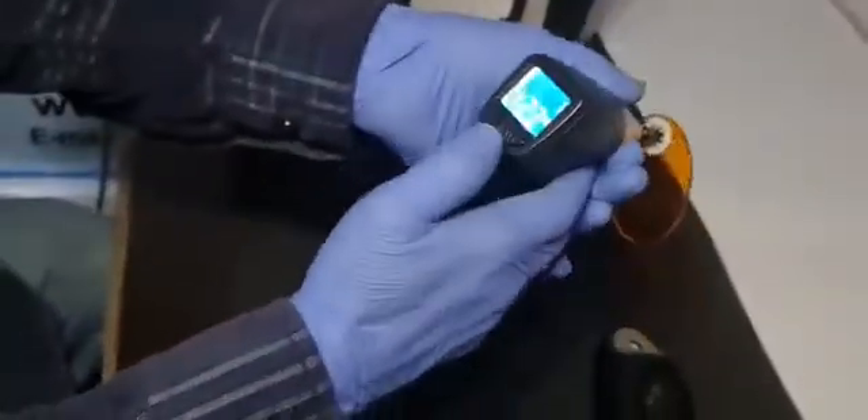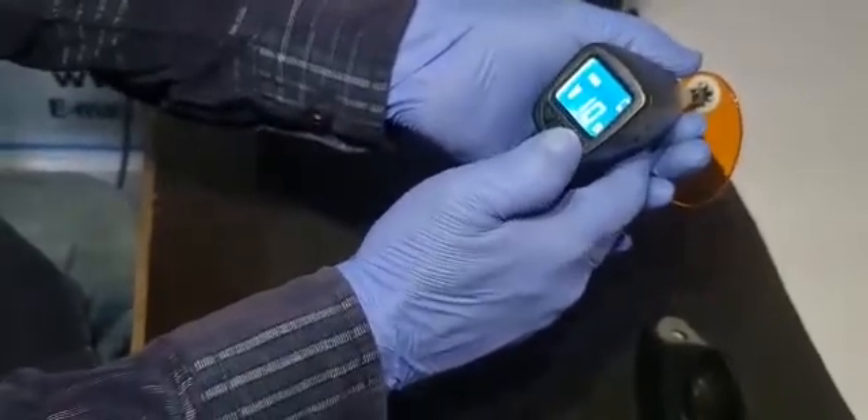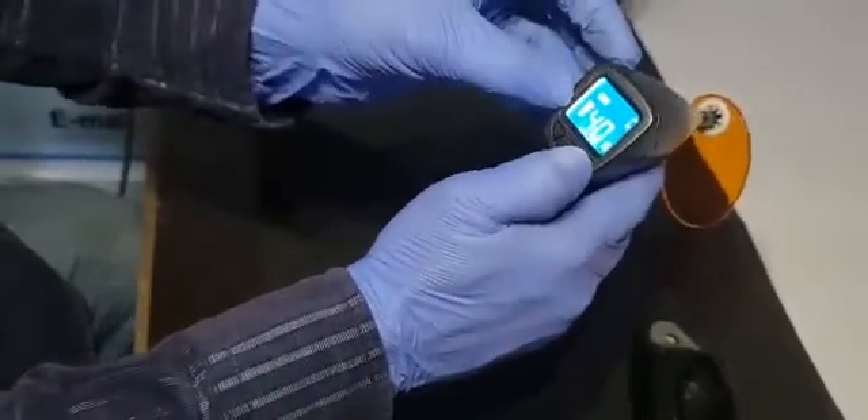The time is in minutes for bleaching. If you want to use it for curing, you can change the probe and change the mode. For curing, the time range is from 10 seconds to 40 seconds, and you can adjust the power also.